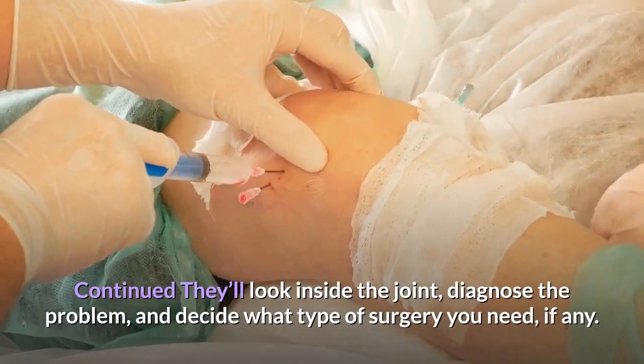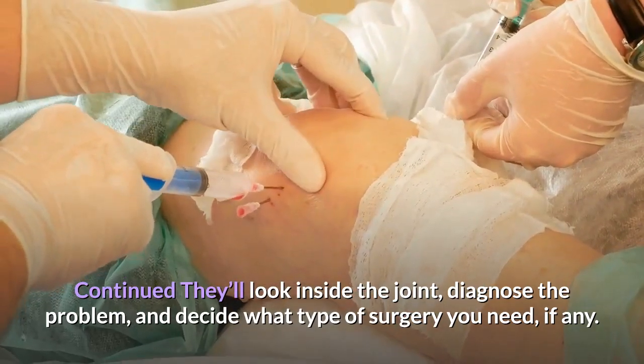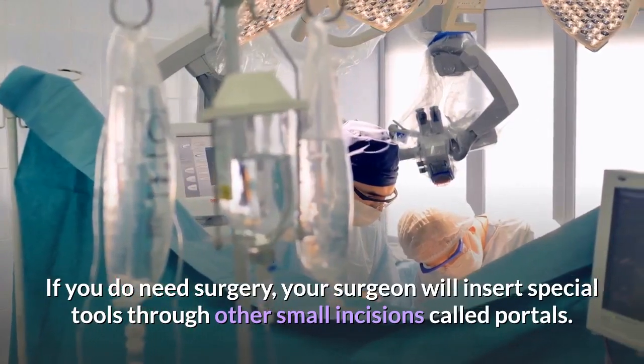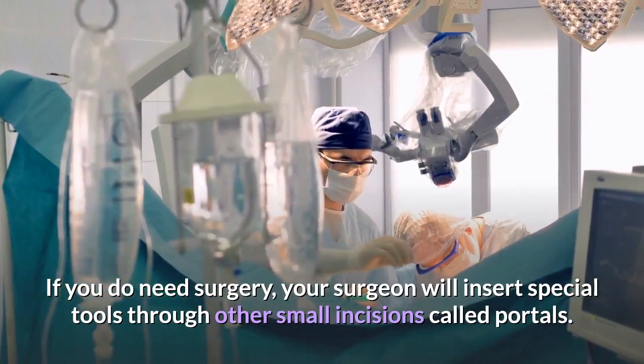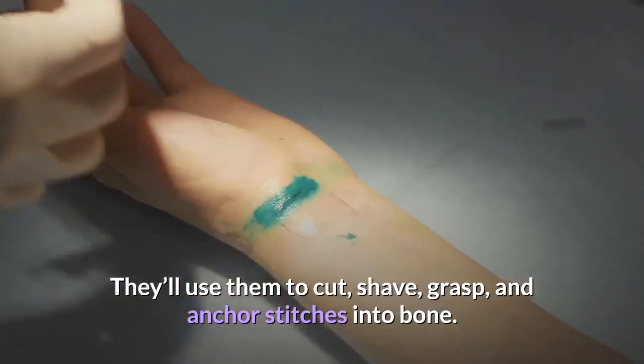They'll look inside the joint, diagnose the problem, and decide what type of surgery you need, if any. If you do need surgery, your surgeon will insert special tools through other small incisions called portals. They'll use them to cut, shave, grasp, and anchor stitches into bone.